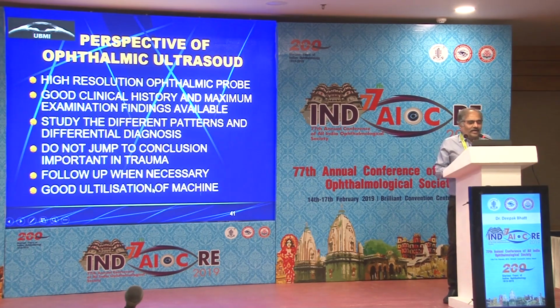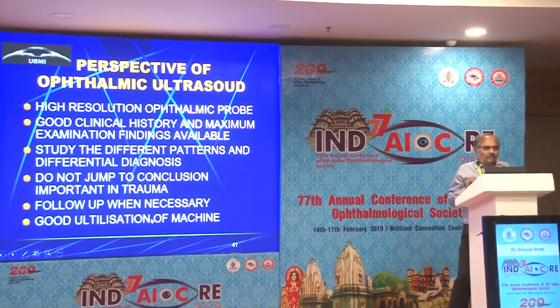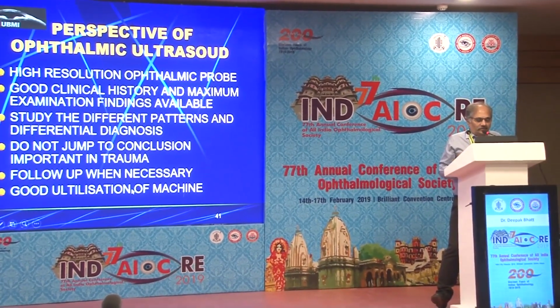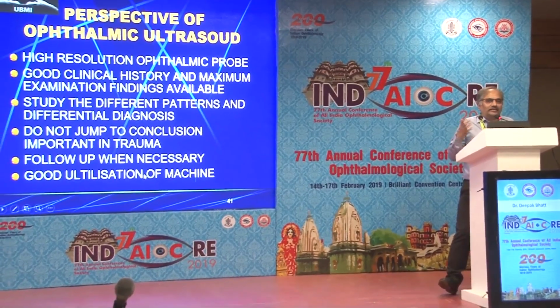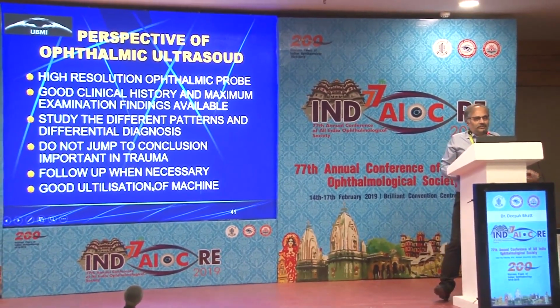So you should have a very high resolution ultrasound probe and a good clinical history, and the findings will be helpful. Different clinical patterns will help you come to a conclusion. Do not jump to a conclusion in trauma. Follow up these patients, especially before you do any surgery, and then make good utilization of the machine. I told you, you need to play around with the gains to get a complete picture on ultrasound.